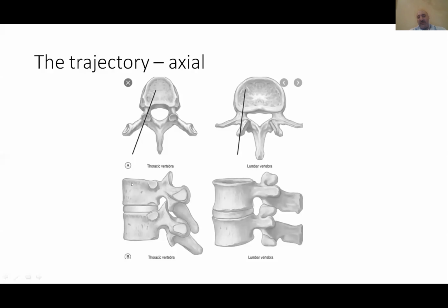So if you put your cement above the middle level of the vertebra, you will end up with a leak to the disc, or sometimes it can even leak anteriorly. So try to avoid the upper third, try to be below the middle half. Put your cement here, and you'll see while you're pushing, the cement will pass to the top and the upper part with time. But if your trajectory goes more horizontal and you start to inject the cement on the top, you'll end up with a leak definitely, even with the new techniques.